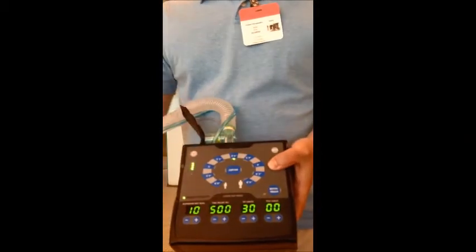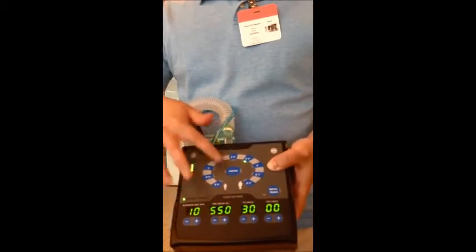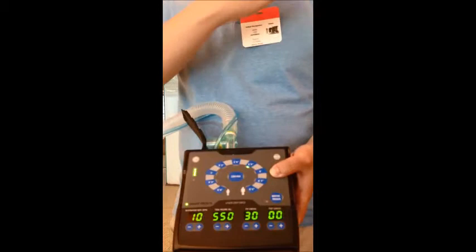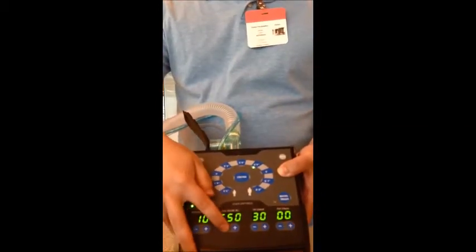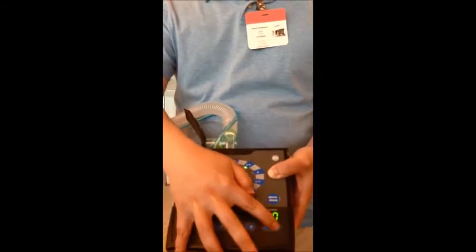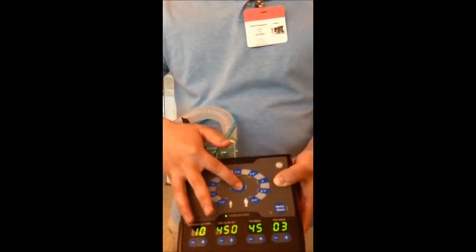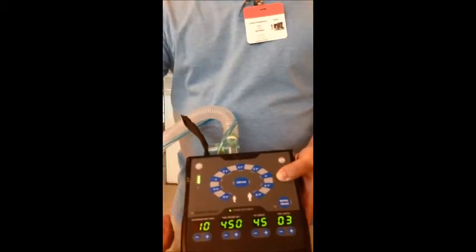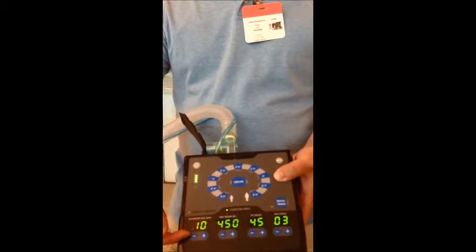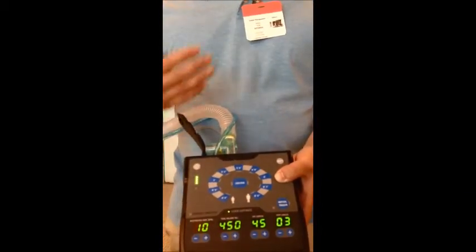If the wrong height was selected for any reason, they can select a different height and just confirm it, and it'll reset it. However, if a physician comes in that needs to override the device, they can change the ventilator settings by changing the tidal volume, they can change the peak inspiratory pressure, or even put PEEP in the unit. Once they change all those, they confirm it, and now it's overridden for these particular parameters for that patient, whatever they need.